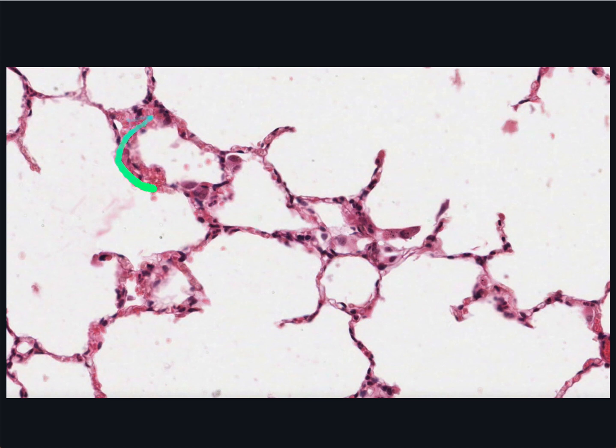The two other cell types located in the interalveolar septum or alveolar surface are type 2 epithelial cells, or type 2 pneumocytes, or septal cells, and macrophages. Type 2 cells are cuboidal and usually occur in the corners where two interalveolar walls come together. They produce surfactant. Picking out type 2 cells in hematoxylin and eosin sections is not easy, but perhaps this is one over here, and perhaps another one here.